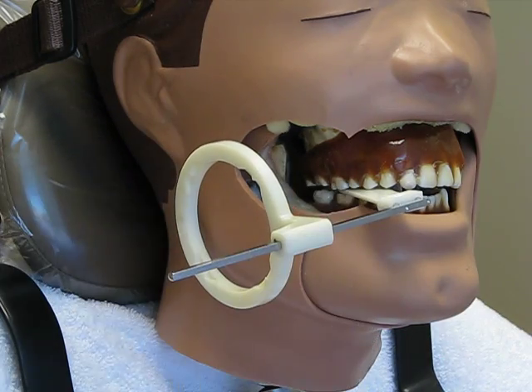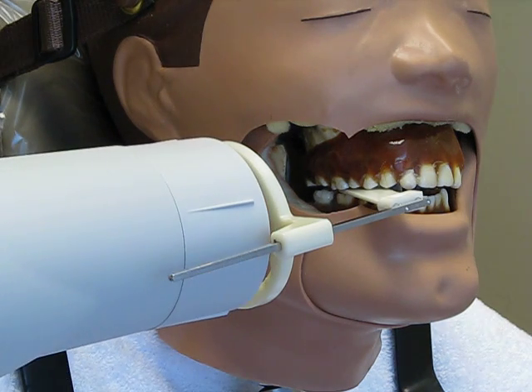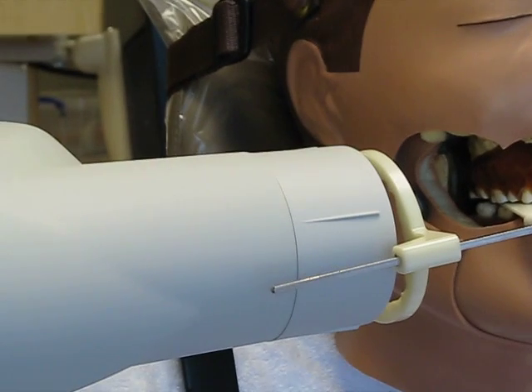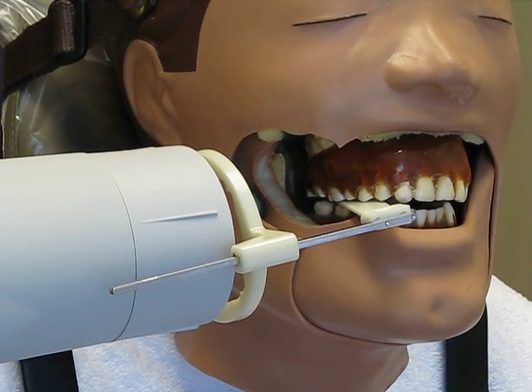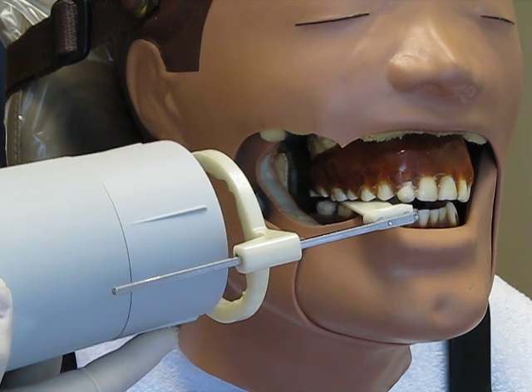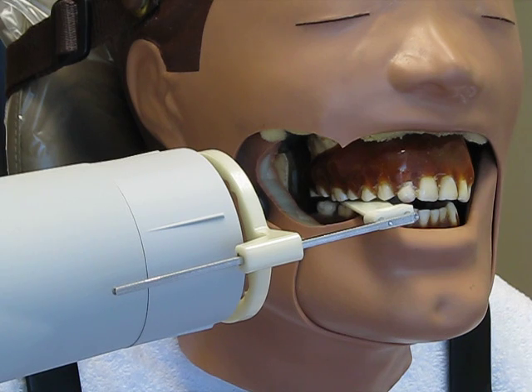Bring the ring back just a little bit. Bring my tube head, and just make sure I can see. Okay, let me move you over just a little bit more so you can see what we're doing. Okay, here's the indicator line. Here's my indicator rod. I need those to be parallel as much as I can. I can't go down any further because, I don't know if you can see, and I'll move it over a little bit.